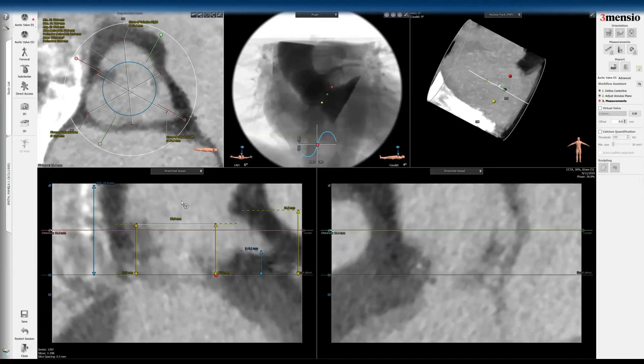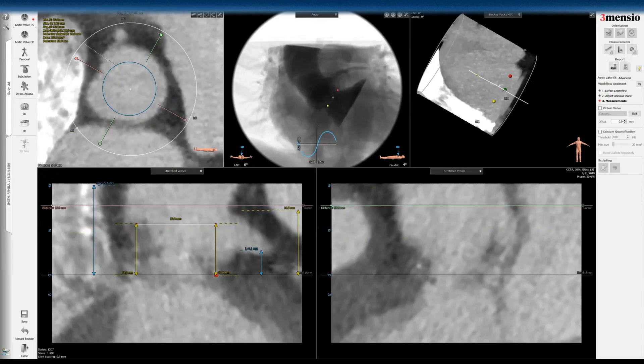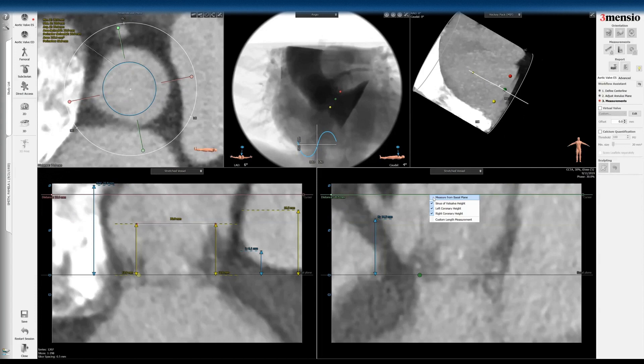Because of that, I'm not really going to measure any VTC here. I'm going to go straight to the safety measurements on the left cusp, and then go through here by setting the right coronary. You can see the right coronary takeoff is here, and then the right sinus height is here.